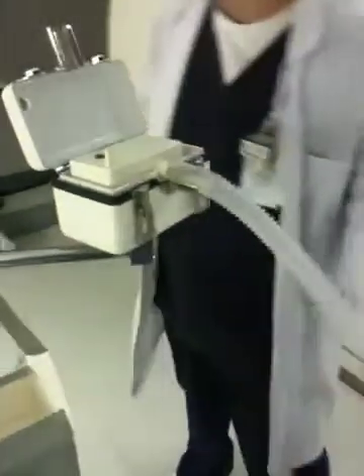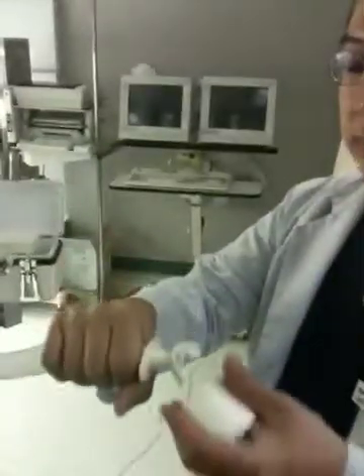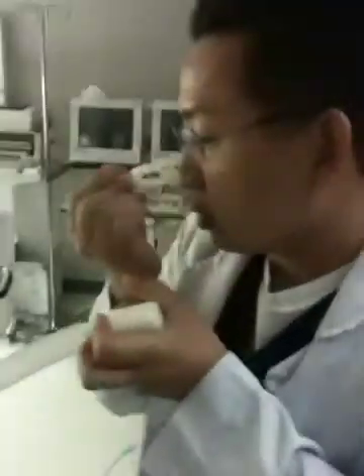So what you do is you tell the patient, 'I'm going to have you breathe into this machine here. When you breathe, cough — just cough in here. Don't take it out because we don't want contamination on the chest.' So take this out, put it in the mouth, pinch it, tell them to start breathing slowly in and out. Then you inject the 2 mL into this black nebulizer cup here.